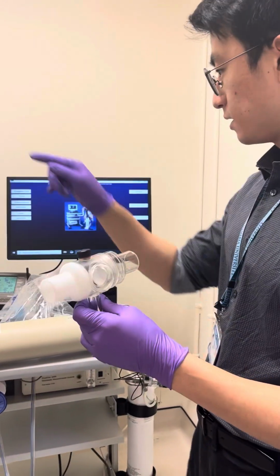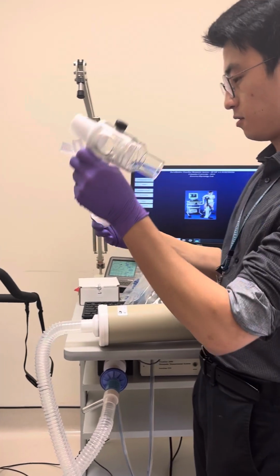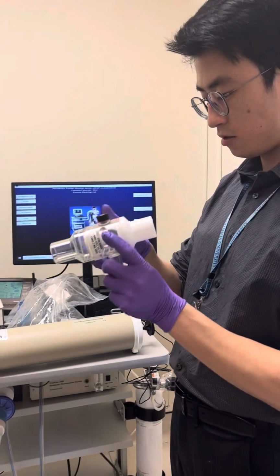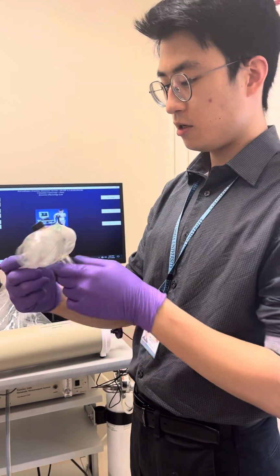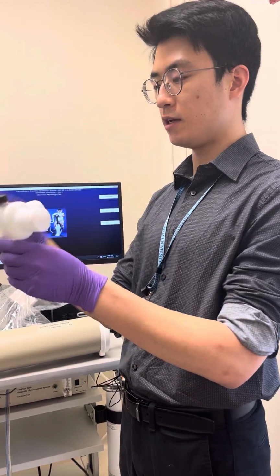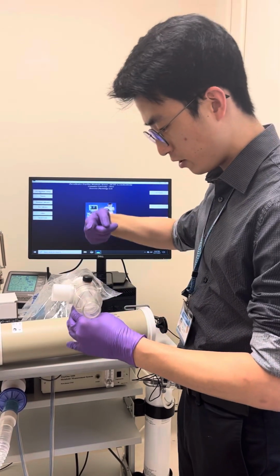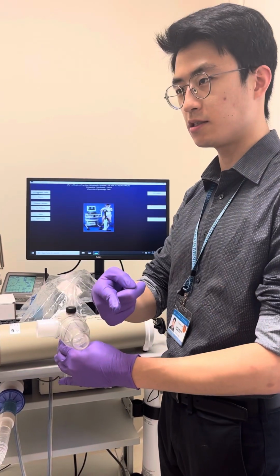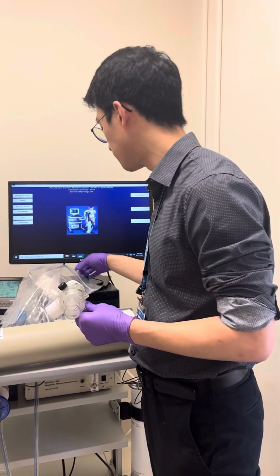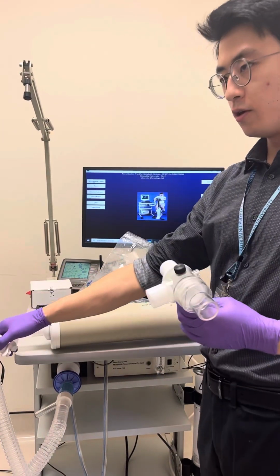And so this is connected to, I get this part. So there are 3 ends. Air comes in, air goes out. So when you breathe in, air goes in like this, and then out like this. Okay, so in like this and out like this, and this is where the patient breathes in. Of course, you need the hose connected to the machine.